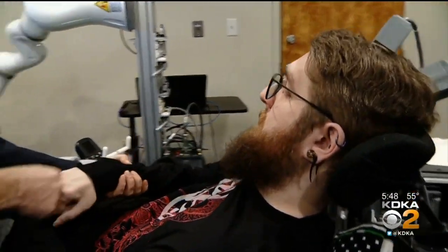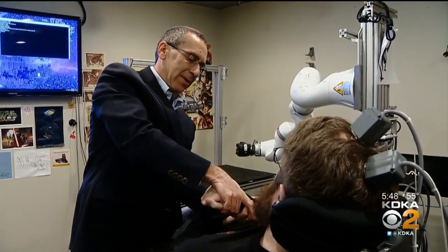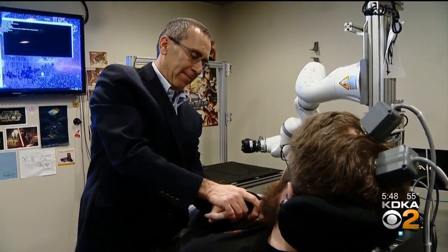So when I press on something, I get immediate feedback as to how hard I'm pressing, and it modulates how hard I press. Or when I'm trying to button something, I know where my fingers are without having to look at them. And those are 2 really critical things that we need to work on in the next several years. Even being able to reach out and pick up an object and bring it to you, to scratch your face, to itch an itch without having somebody do it for you. These are the sorts of things that are really meaningful to people who can't move at all.